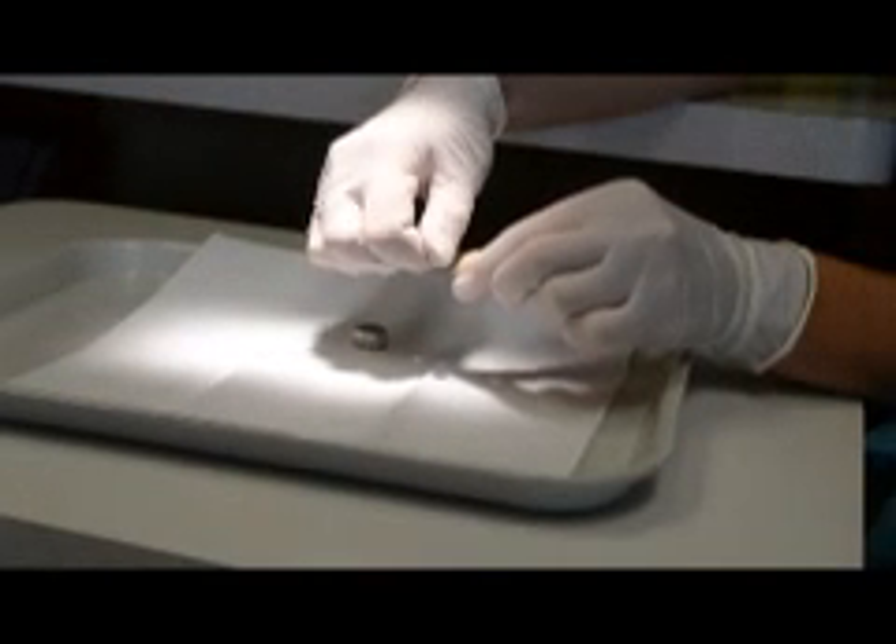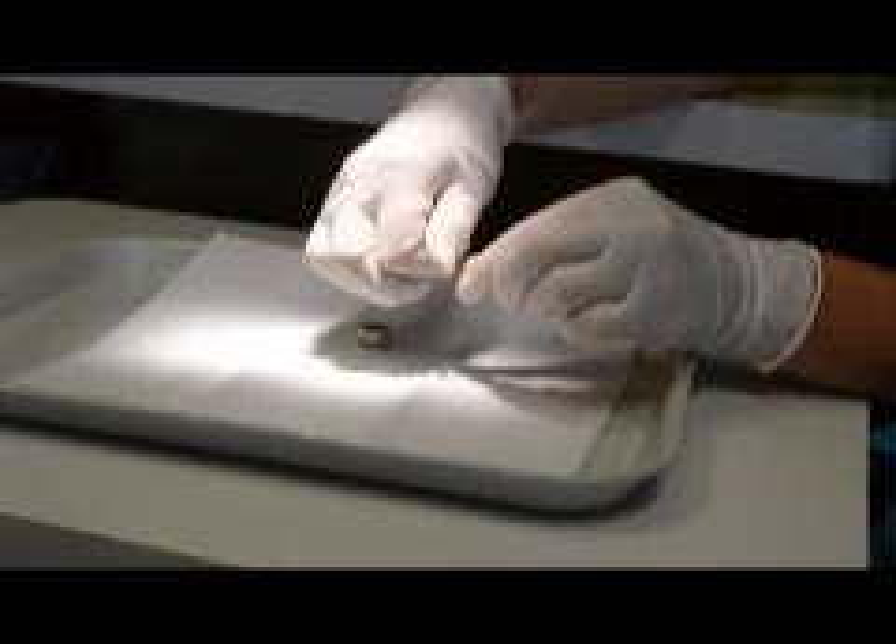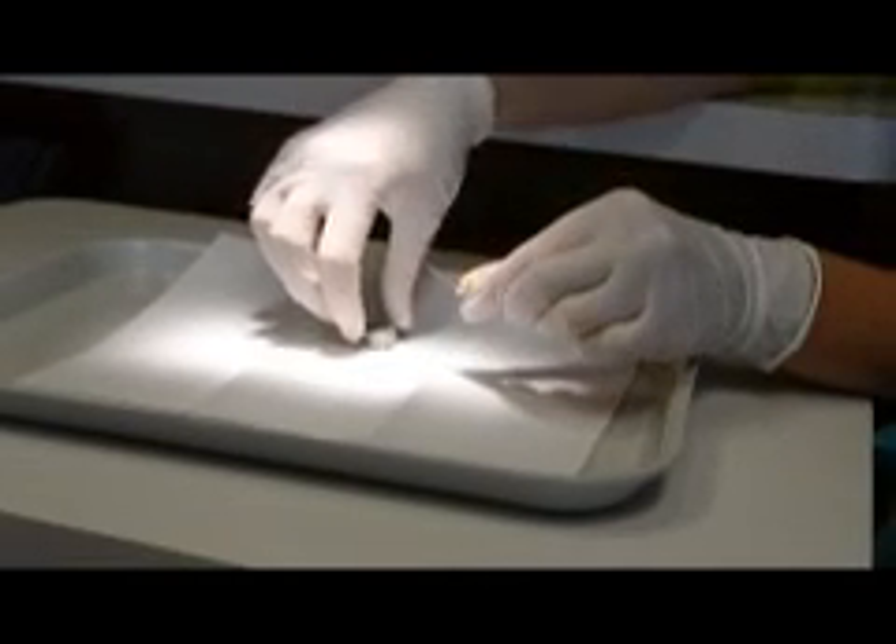Place the extractor in the hole and tighten it with your fingers. You should probably only be able to turn it in one or two threads.